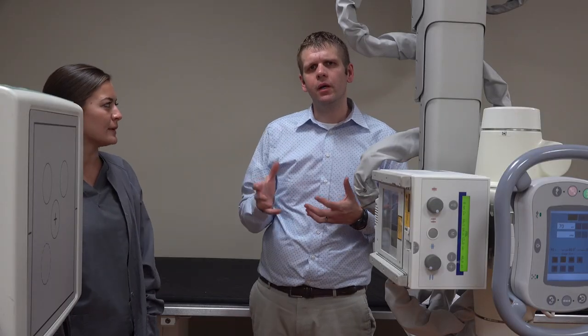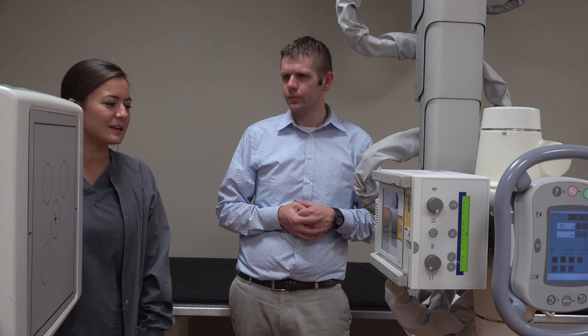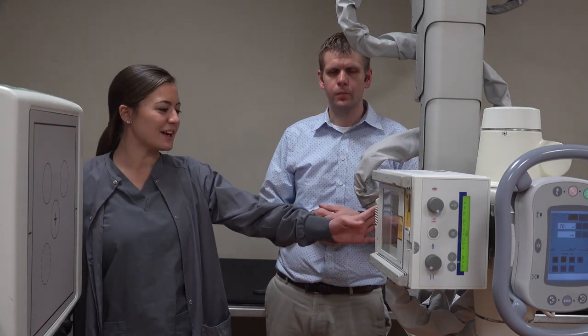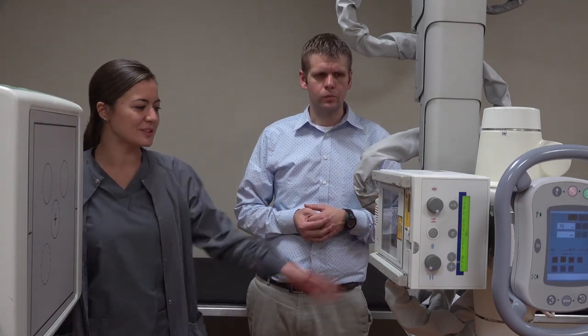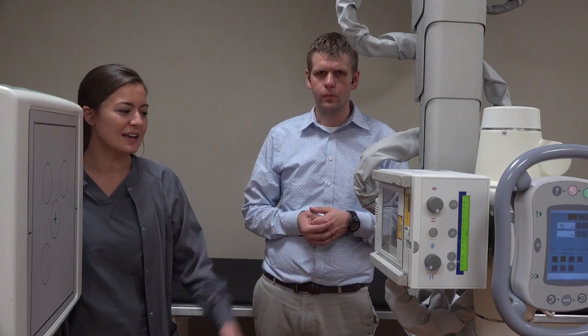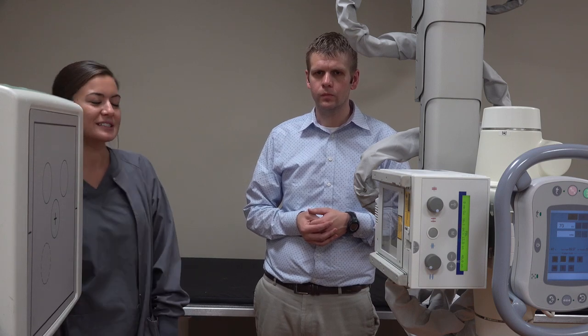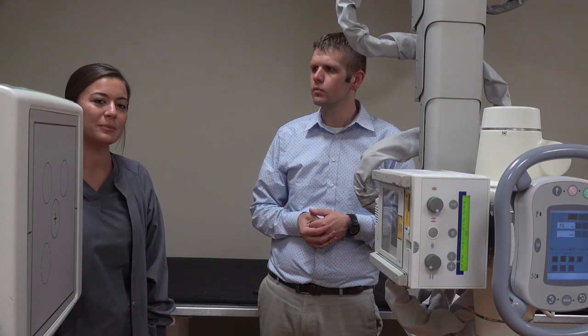Okay, so here we are in the x-ray room. Stephanie, can you give us a little bit of a tour? Well, here we have the tube, and this is where the x-rays come out of. And then between the tube and this image receptor here, we have the patient standing. And the x-rays will go through the patient and go to the image receptor, and based on the different densities of the patient, we'll decide what colors show up on the picture.